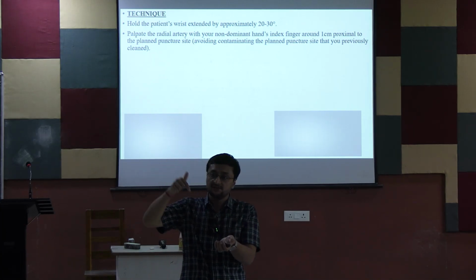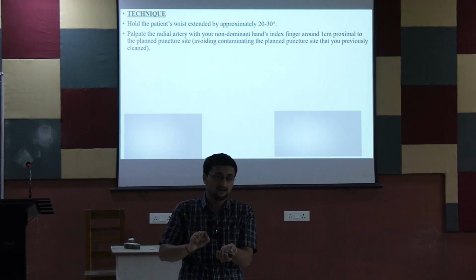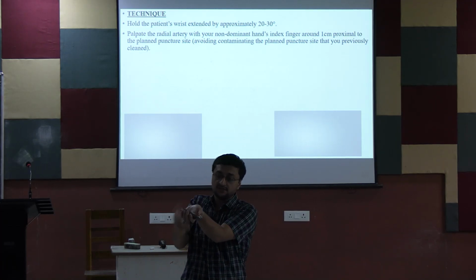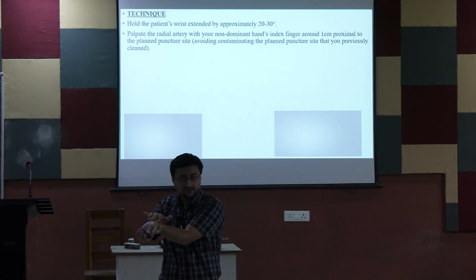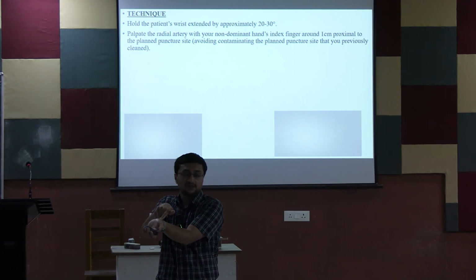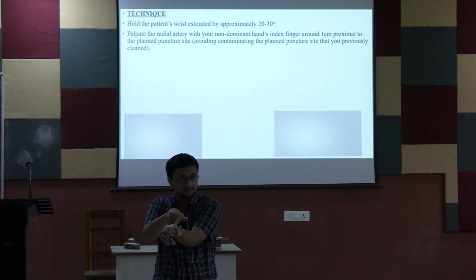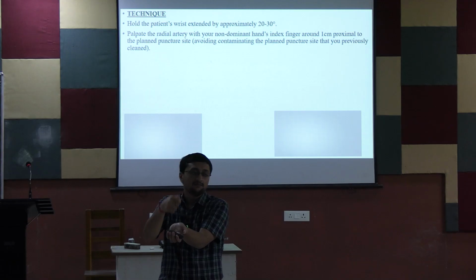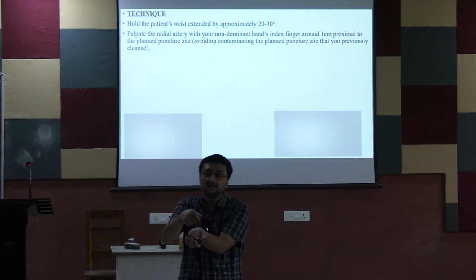Hold the syringe at 30 to 40 degree angle, এরকম ভাবে ঢোকাতে হবে, ঠিক আছে? রিস্ট এখানে একটা সাপোর্ট, এটা palpation হলো radial artery. Just insert your needle at the 30 or 40 degree angle. Okay, slowly insert the needle and applying the negative pressure.